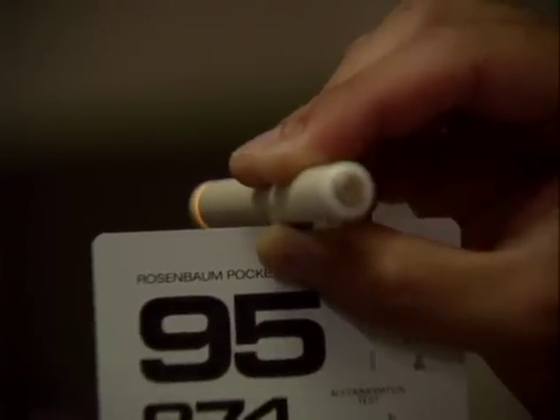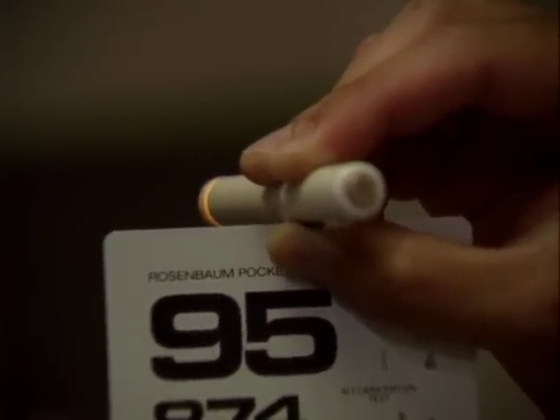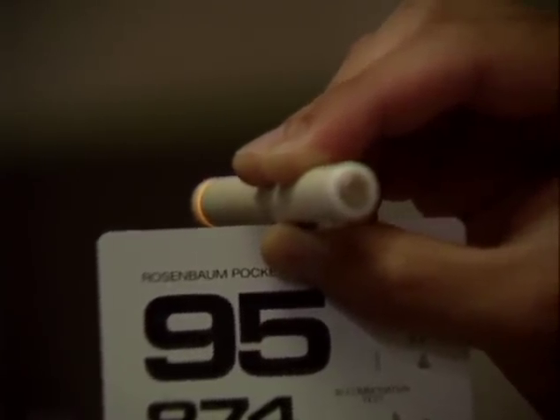Using a fixation target and a pen light or other small bright light source, hold the light next to the target, asking the patient to look at the target and observe where the corneal light reflex falls in each eye in relationship to the pupil. Normally, the light reflex should be located centrally or slightly nasal within the pupil and symmetrically in both eyes.